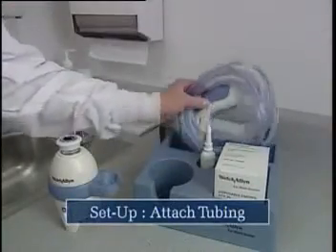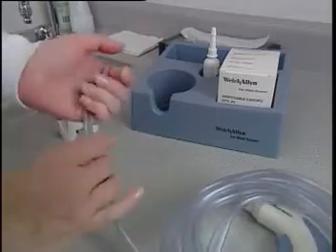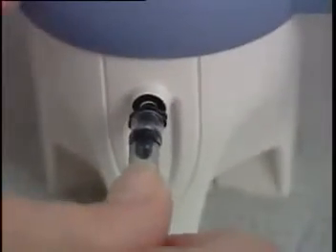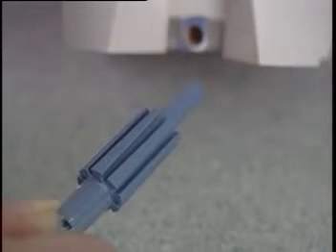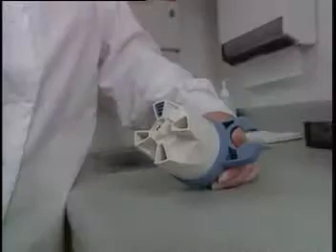Connect the flexible tubing to the pressure chamber. The tube with the black connector, which will suction out water from the ear during the procedure, should be matched to the black port on the side of the chamber. The tube with the blue connector, which will introduce water into the ear, should be matched to the blue port on the lower side of the chamber.